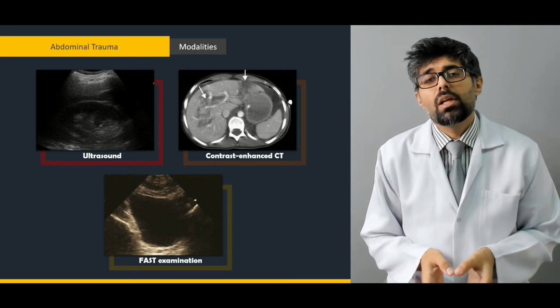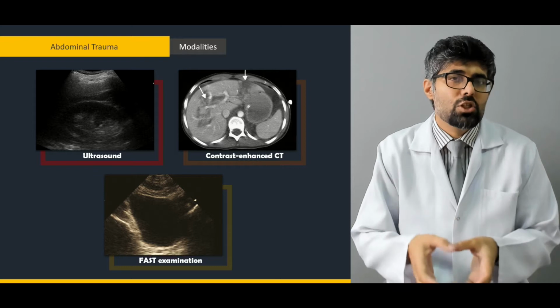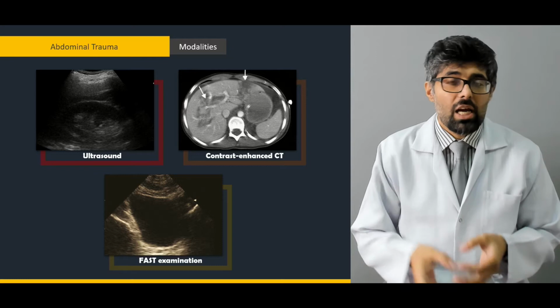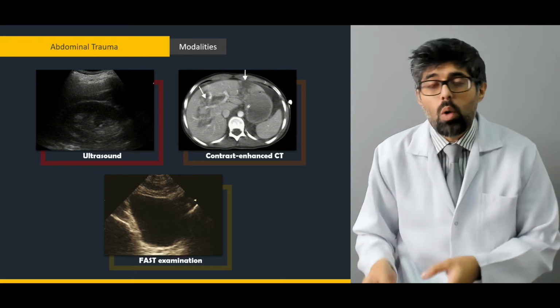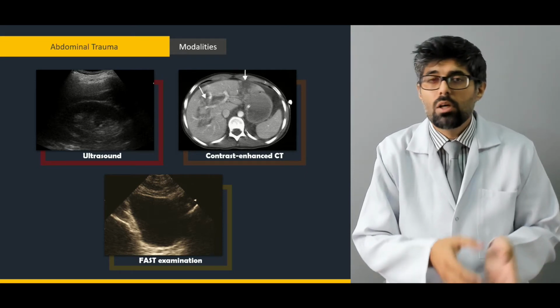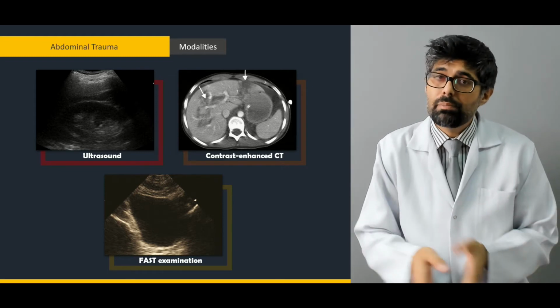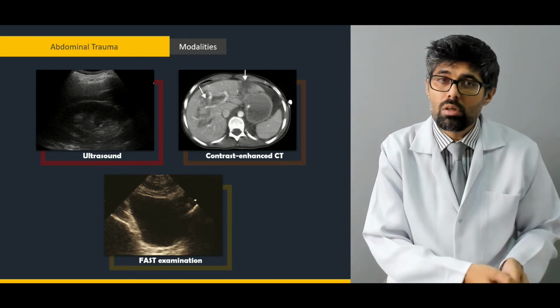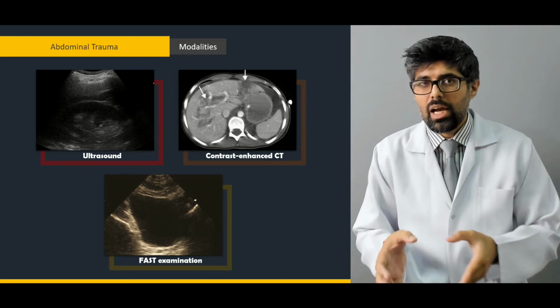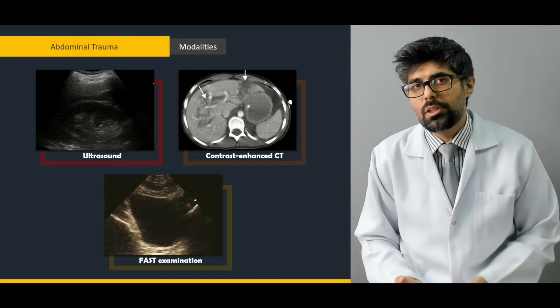For FAST examination, we have a handheld device which gives us immediate and quick responses and images, and this can be done while the patient who has suffered trauma, either blunt or penetrating, is being resuscitated, is being stabilized, and is being treated. So FAST examination, being handheld and of ultrasound origin, can be performed in the emergency department.